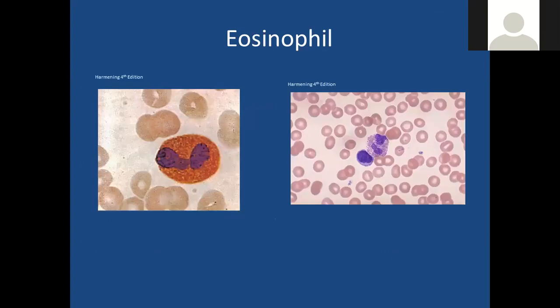All right, so this just illustrates the characteristic orangey granules of your eosinophil. Notice the bilobed nucleus, notice the orange granules. Versus your neutrophil, it has a more pinkish coloration to the cytoplasm, and the secondary granules are very purplish. Does everybody make sense? So this is a segmented neutrophil, eosinophil. And then what cell is this? That's a lymphocyte. Yes.